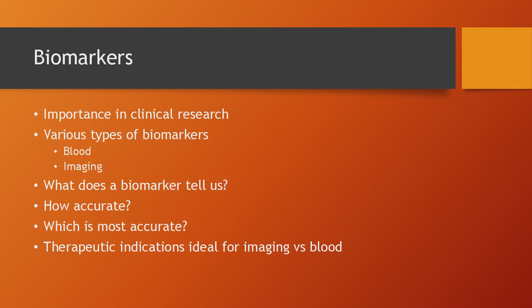In lungs, we can see where the emphysema is, where the most aggressive cells are in a tumor. So we have this space delineation that is so powerful, right? For example, for guiding biopsies, or for seeing where the tumor is developing the necrosis area, and I think this is the most important part, right?